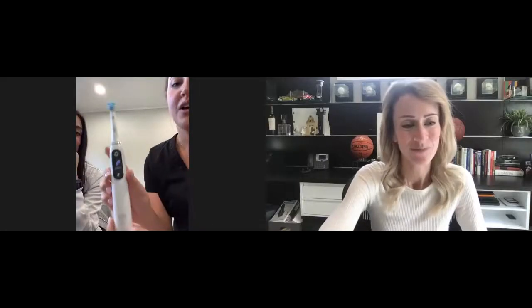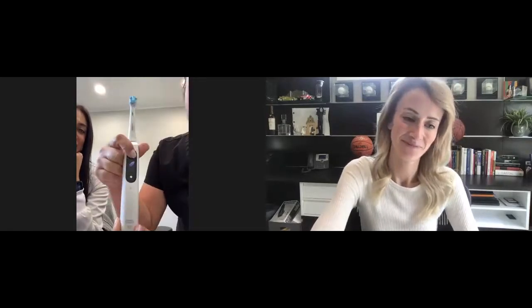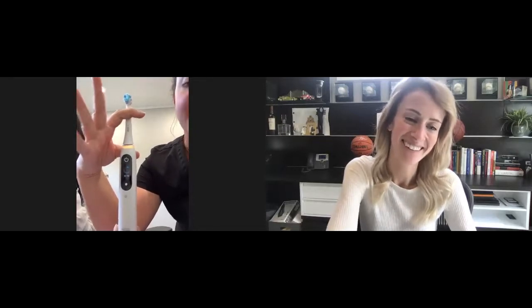So this is the Oral-B iO. All right. So you're going to go ahead and turn it on. First of all, you can hear that it's relatively quiet. When you're brushing, you see how you have that green light? That green light is the perfect amount of pressure when you're using it. If you press too hard, can you see the red? That means you are pressing way too hard. So you want that nice green light.